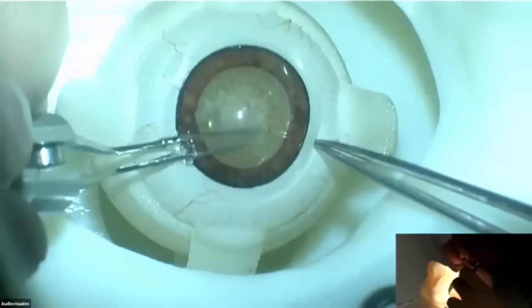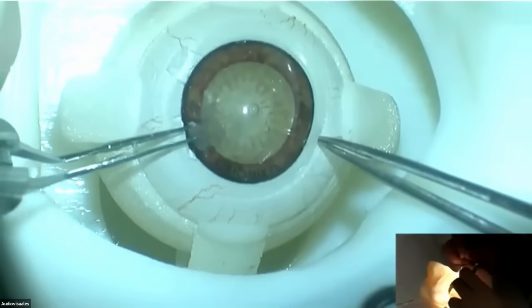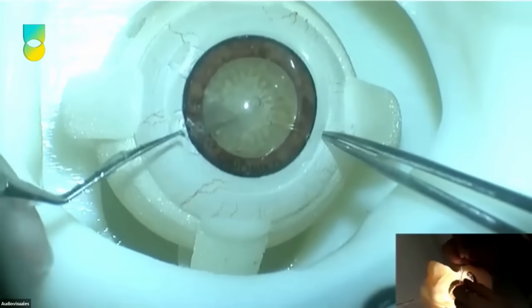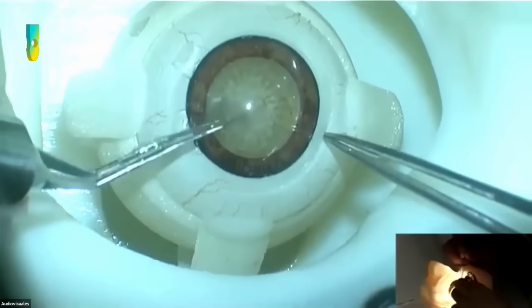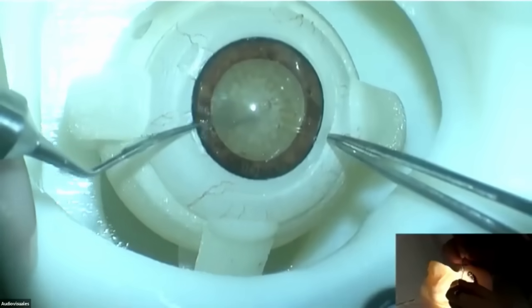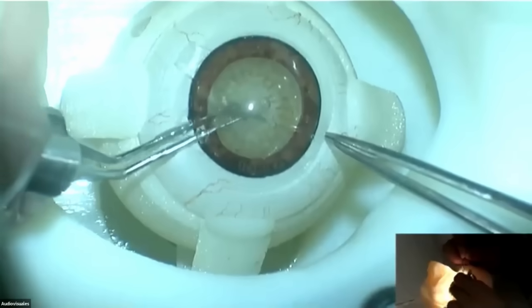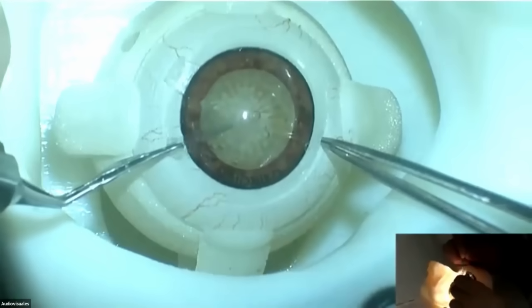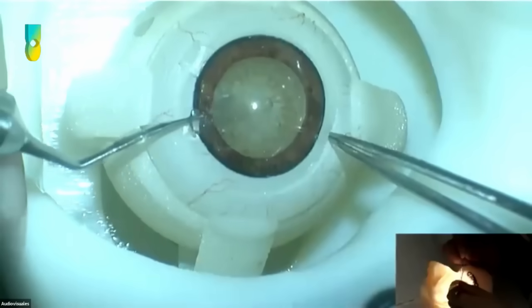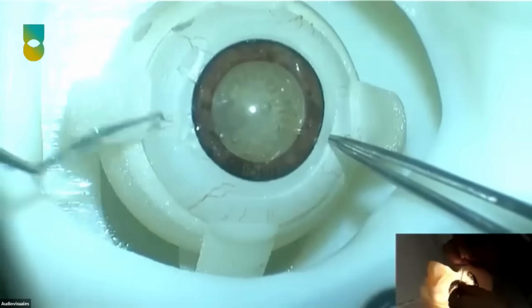Yes, very good one, and it will allow you to stabilize it. But then again, if you do the movements correctly, you will not need to stabilize it because the eye will not know that you're in that incision. She's doing an amazing job and an amazing capsulorhexis. Ricardo, are you there with us to have some inputs about this? So yeah, she did very well, this capsulorhexis, fantastic.